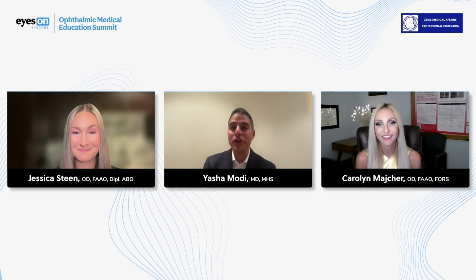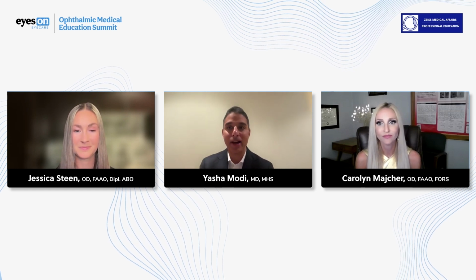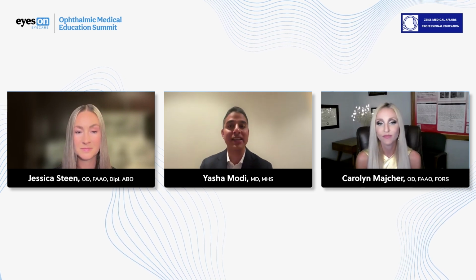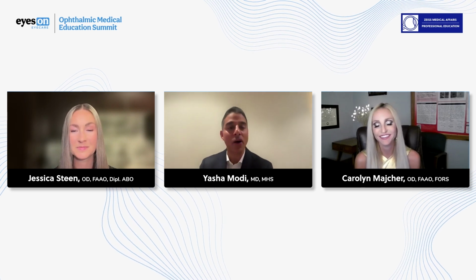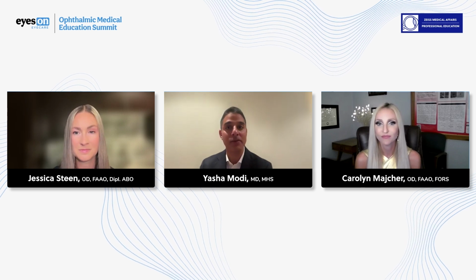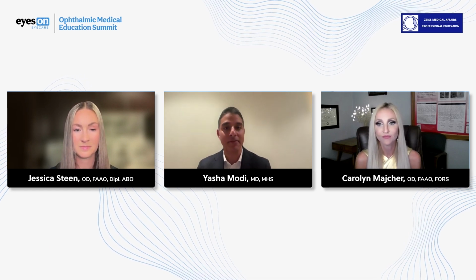Absolutely. And there are medical implications there. To go to that polling question we had, the question was: are all of the following findings that can help differentiate a BRAO from a BRVO, except? These are those horrible questions that bring back terrible memories from back in school taking exams. But inner retinal thinning oftentimes cannot help you differentiate between a BRAO and a BRVO. Looking at the development of collaterals, which is a unique feature to venous occlusion, can be very, very helpful.